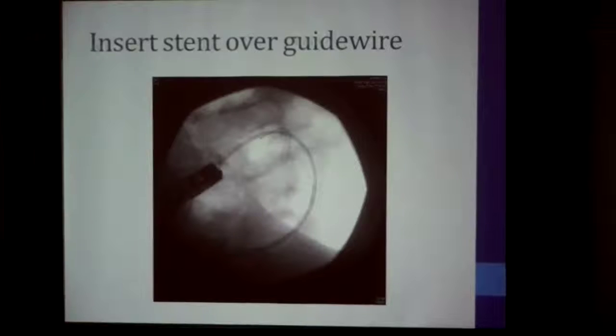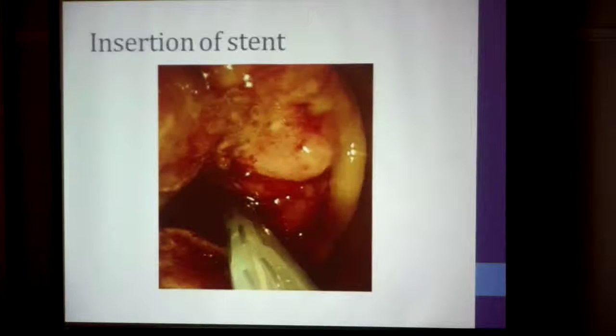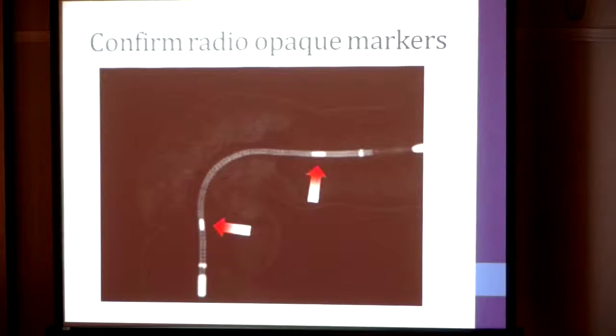This is the image intensifier view of the stent going through. If you look carefully you can find one of the markers of the stent, which is a slightly darker marker, and another marker on the other side. This is the endoscopic picture as you pass the stent through — you can actually see the stent through the plastic. This schematic diagram shows you must ensure that two markers, one proximal and one distal to the tumor, are correctly positioned.